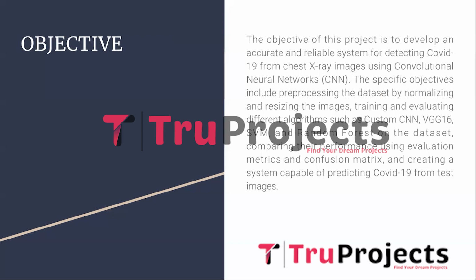The project encompasses several specific objectives, which include preparing the dataset by standardizing and adjusting the image sizes, conducting training and evaluation procedures using various algorithms like custom CNN, VGG16, SVM, random forest, and many more on the dataset, comparing their effectiveness using the evaluation metrics and confusion matrix, and ultimately developing a system which is capable of accurately predicting the COVID-19 presence from test images.